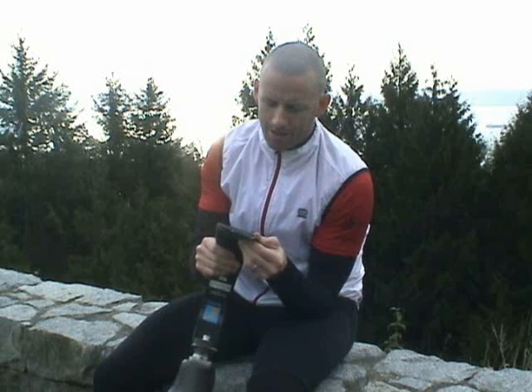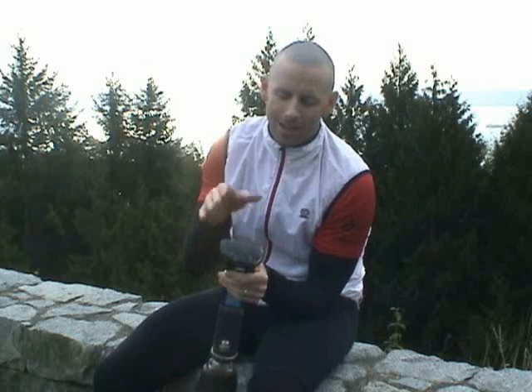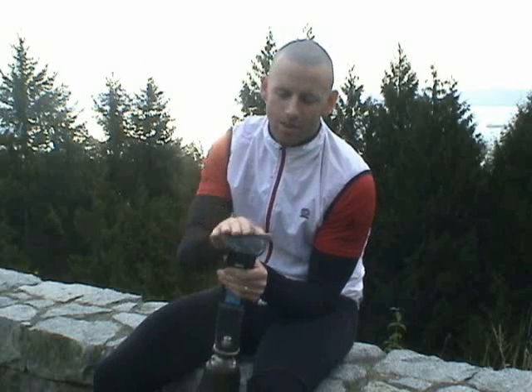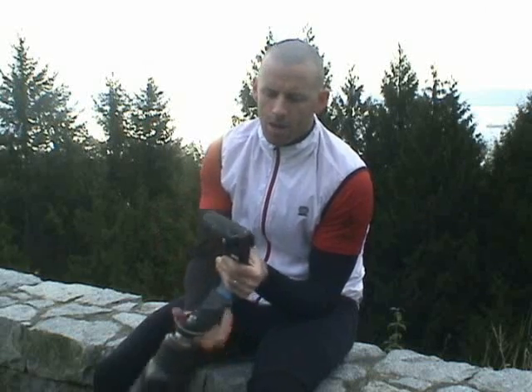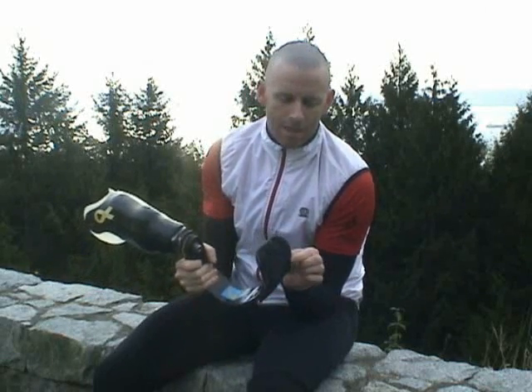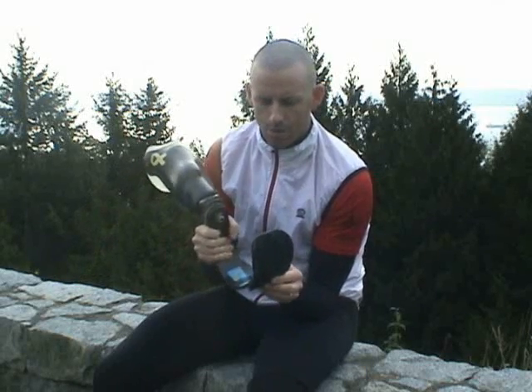And three, I believe, and I have found it to be grippier. I tried the other way and I like this more. It gives me a better contact with the ground. I do give up a little bit in the weight department, though. It's a bit heavier, but it's a choice that I don't mind making.